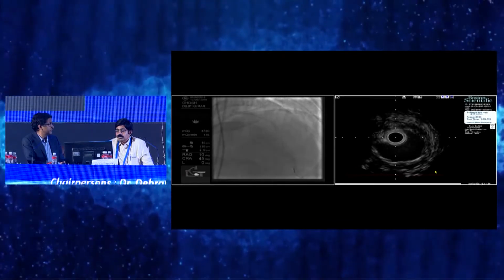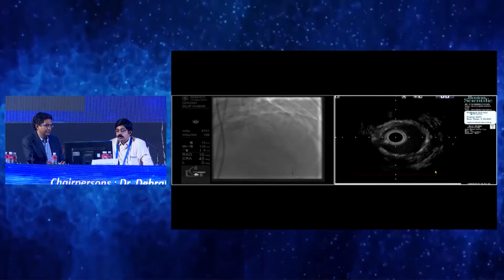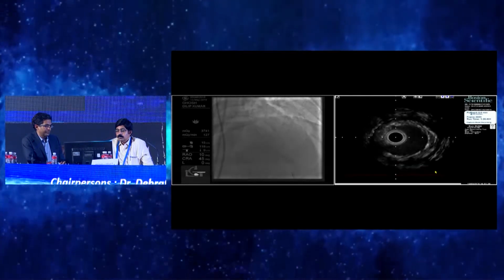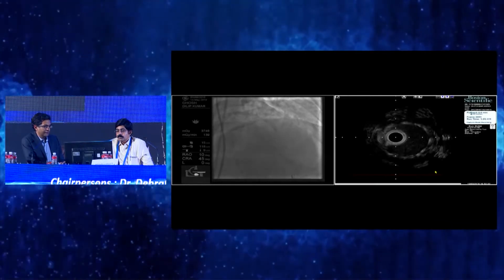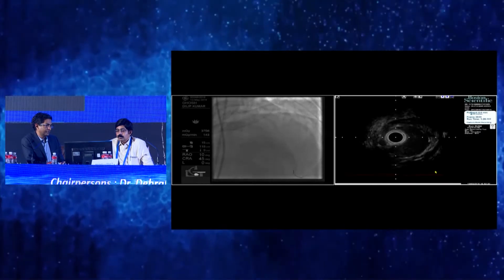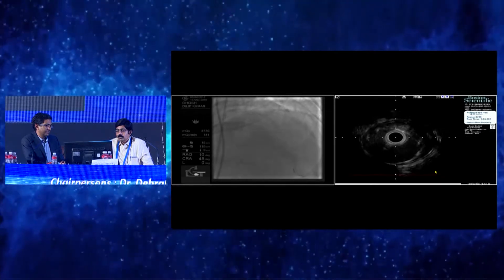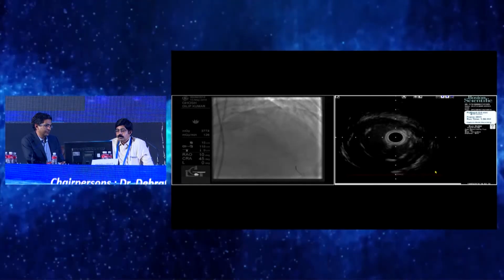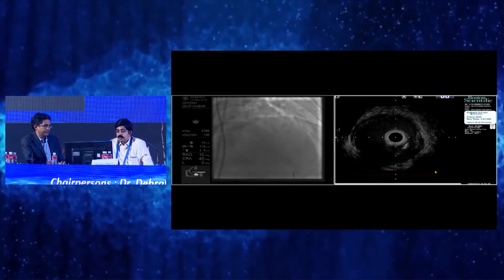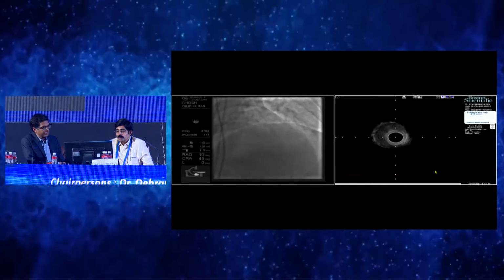And this was what you were worried about, Ramesh, what would happen to the proximal segment. Yeah. And see, we have dilated this with a 3.5 balloon to 20 atmospheres, in the proximal segment. And you can see that there is good apposition. There is no malapposition. I'm just withdrawing it slowly all the way up, and maybe this last few millimeters, we can go up with a 4 millimeter balloon, just here. Yeah. And there we are just in the left main. Okay? So that was the IVUS.